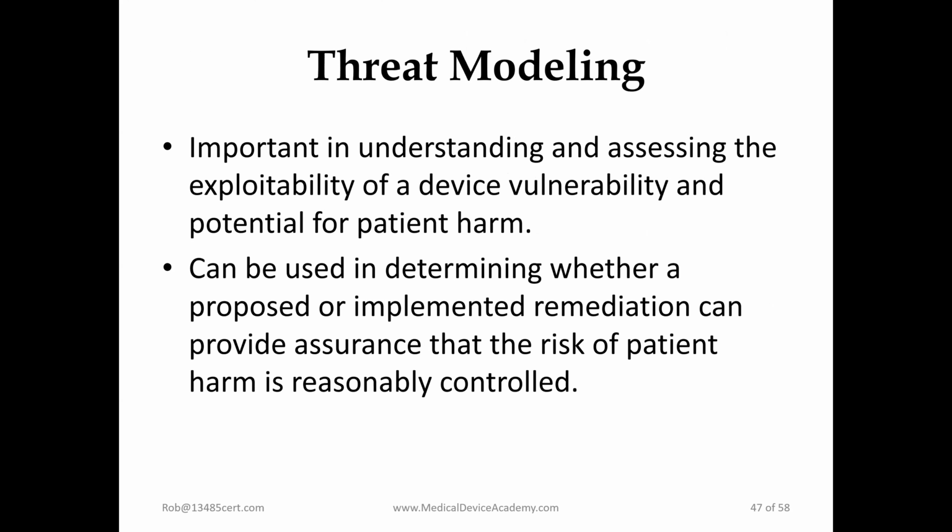So threat modeling is basically an exercise where you look at it from a hypothetical attacker perspective and identify their potential objectives and vulnerabilities they might try to exploit. And then you define countermeasures to prevent or mitigate those threats. So this is just, again, one part of your post-market plan for cybersecurity. Next slide, please.